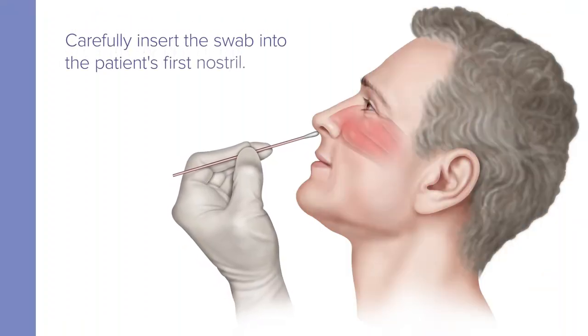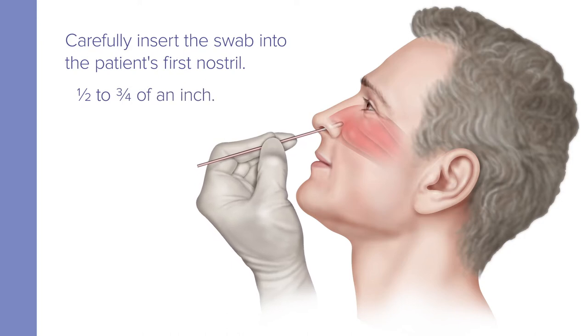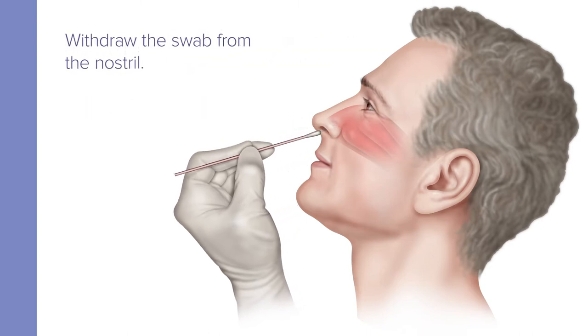Now carefully insert the swab one-half to three-quarters of an inch into the patient's first nostril until resistance is met at the level of the turbinates. Next, rotate the swab with moderate pressure against as much of the wall of the anterior nares regions as possible, in a large circular path at least four times, which is about 10 to 15 seconds. Then remove the swab from the nostril.